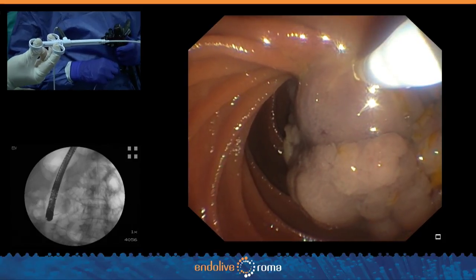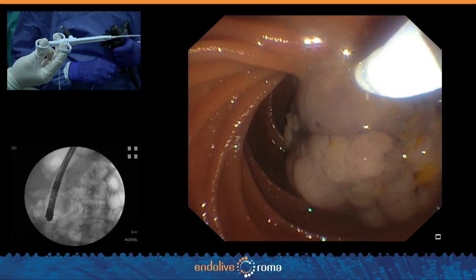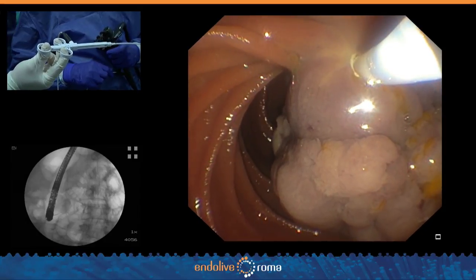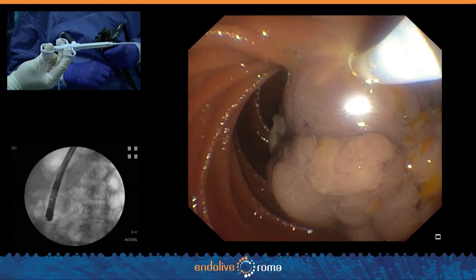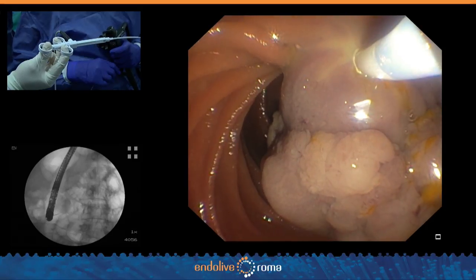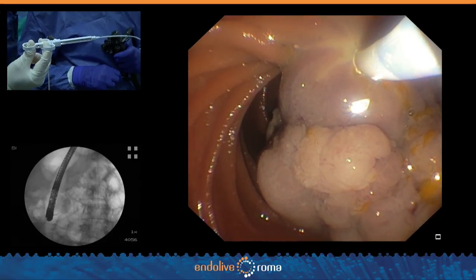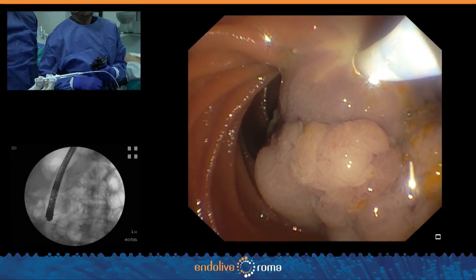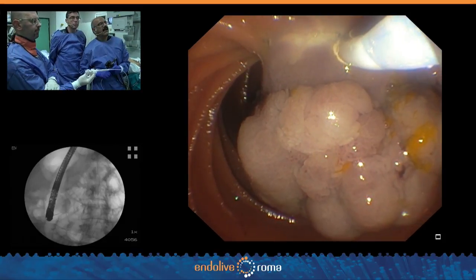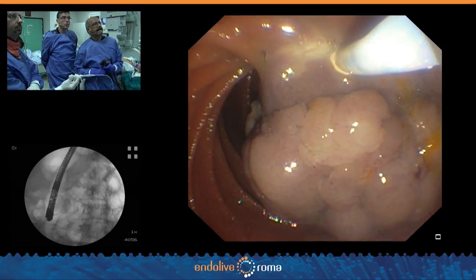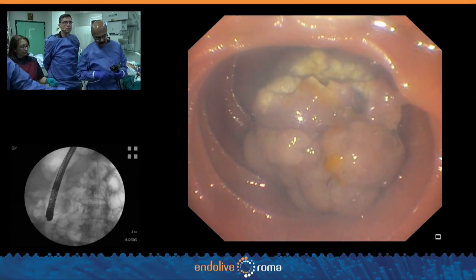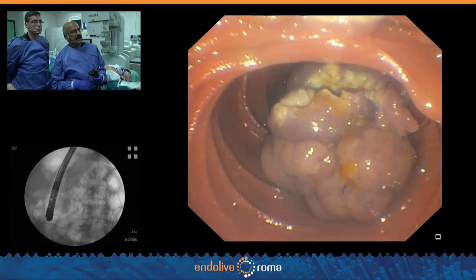It's very large. When you cut the stalk, you should easily see the biliary orifice and pancreatic orifice afterwards. Hopefully we'll see the orifice after this, and then we can think about pancreatic cannulation. The stalk is so large it's nearly finished now — fantastic. Now going quickly into the retrieval basket. The specimen has been removed and we need to move to another room.